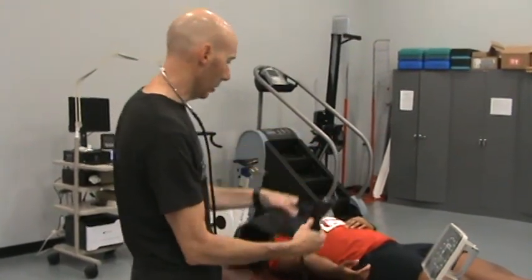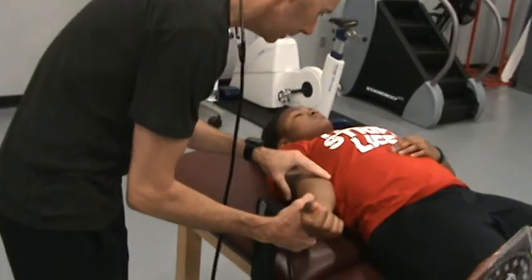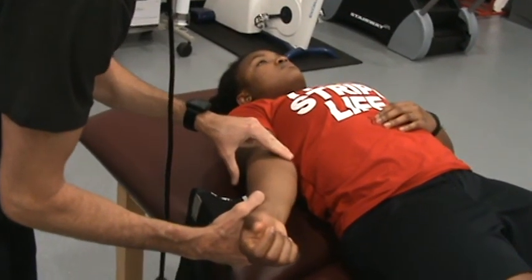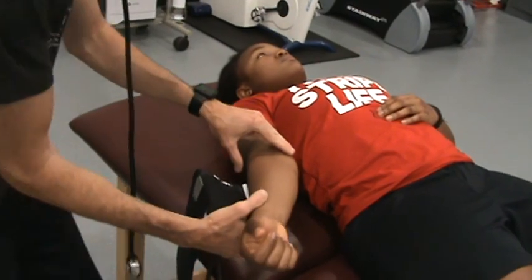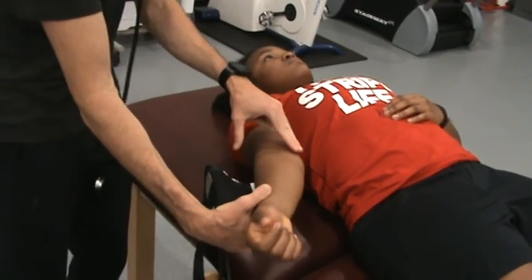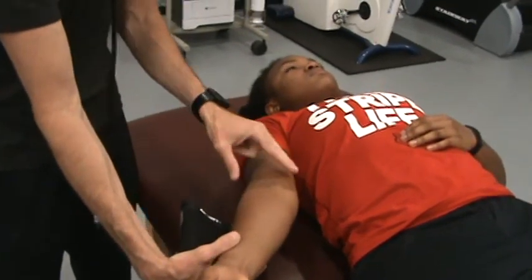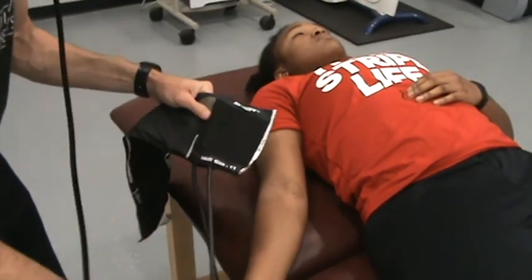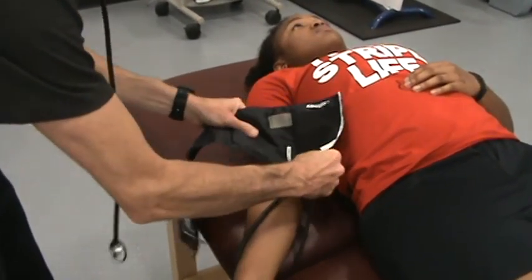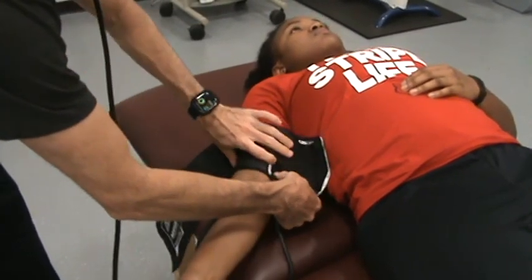Cuff is deflated currently, okay? I'm going to palpate for Lindsay's brachial artery. Usually it is slightly on the medial side of the arm, just below the bicep, but above the crease of the elbow, okay? So I'm going to have her rest that while I place the cuff on. What I like to do is try to pin that mark right where the artery was. And I'm going to hold that there.